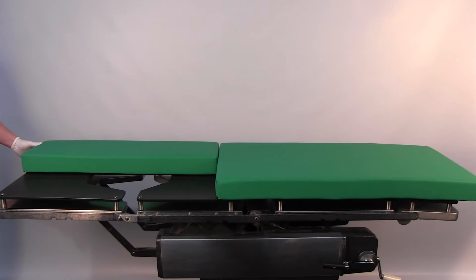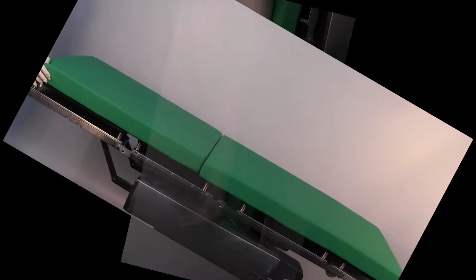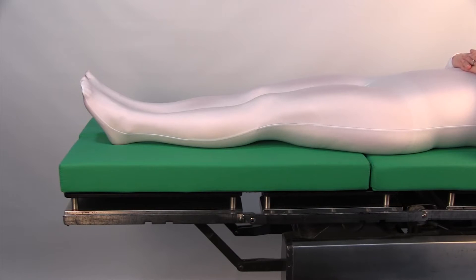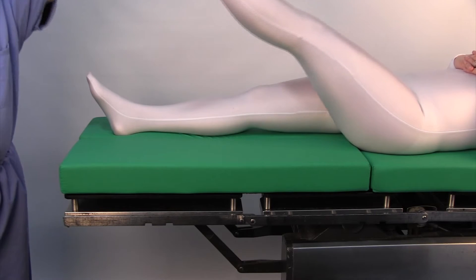Welcome to the IMP DeMaio V2 knee positioner in-service video. Replace the OR table pads with the green IMP knee positioner OR table pads. Position the patient so their gluteal fold is located just above the separation of the OR table pads.